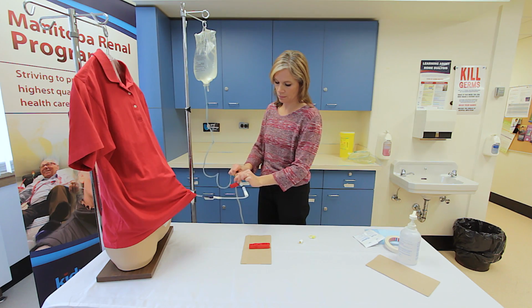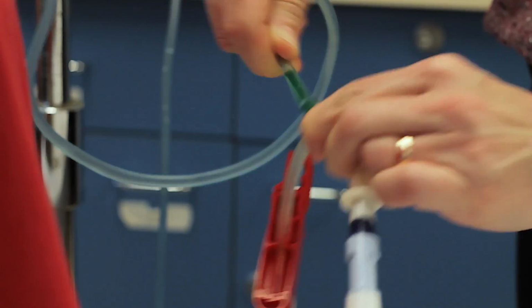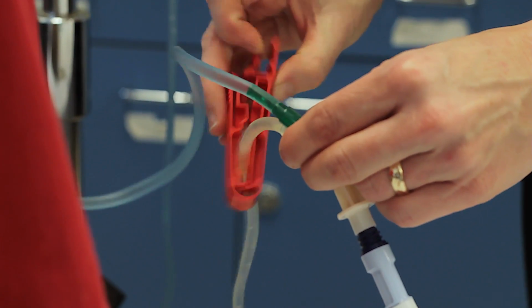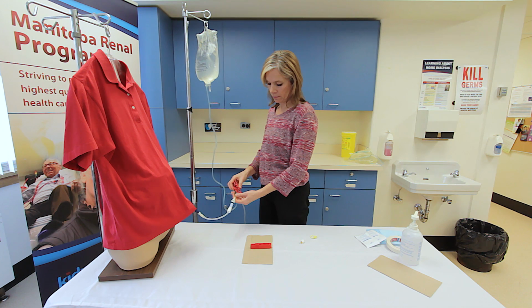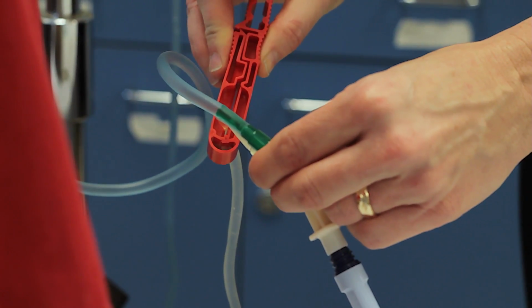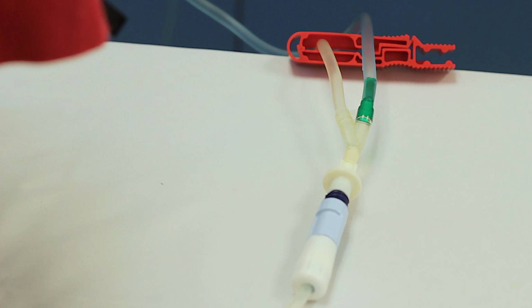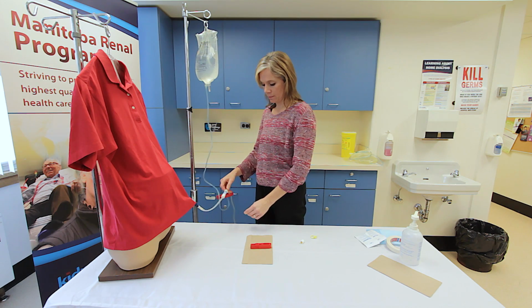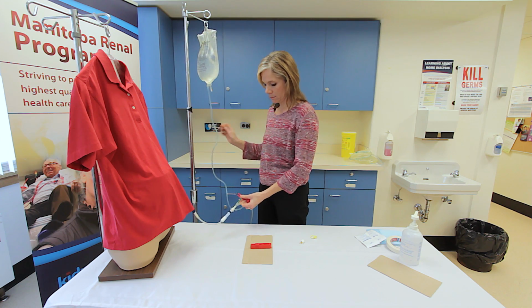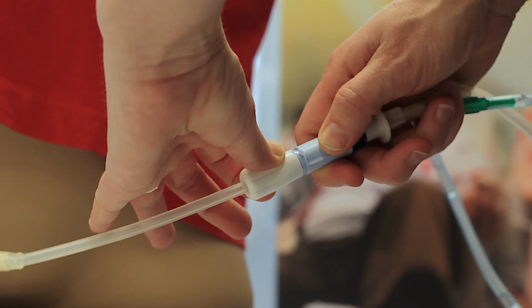Break the green seal on the fill line. To flush the air from the fill line, open the clean clamp on the drain line. Count for 5 seconds. Close the clamp. Do not allow more than 5 seconds to pass to avoid losing too much dialysate in the drain bag. Verify that the air is removed from the fill line and then open the transfer set twist clamp to allow dialysate to flow into the peritoneal cavity.